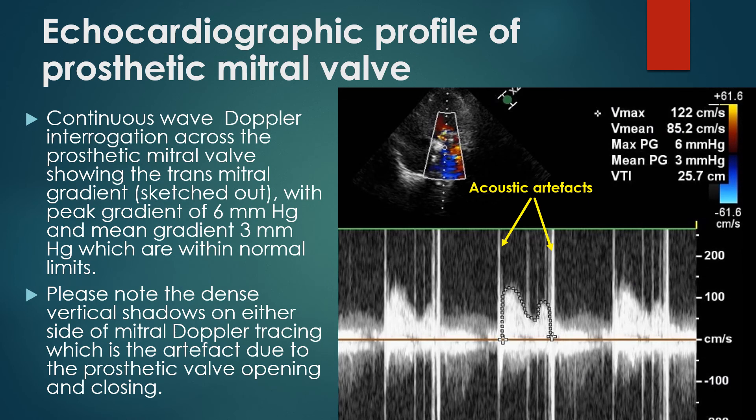Continuous wave Doppler interrogation across the prosthetic mitral valve shows the transmitral gradient with a peak of 6 mmHg and a mean of 3 mmHg, which are within normal limits. Please note the dense vertical shadows on either side of the mitral Doppler tracing, which are artefacts due to the prosthetic valve opening and closing.